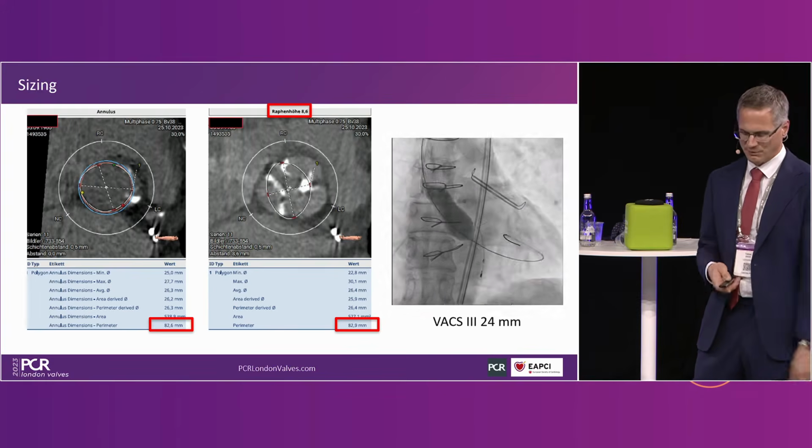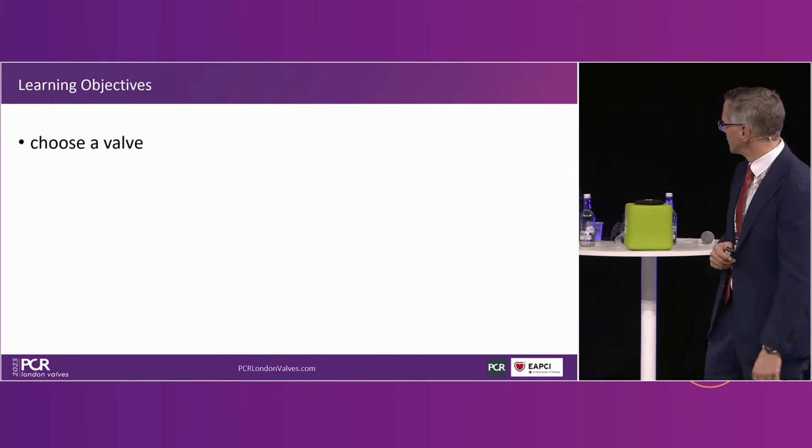So careful. Can I ask the audience a question? With the patient's age being 63, do we adjust the depth of implant in this patient? Because there's the here and now, and there's lifetime management. And I don't think we measured the sinus heights, Darren, but we can assume that.